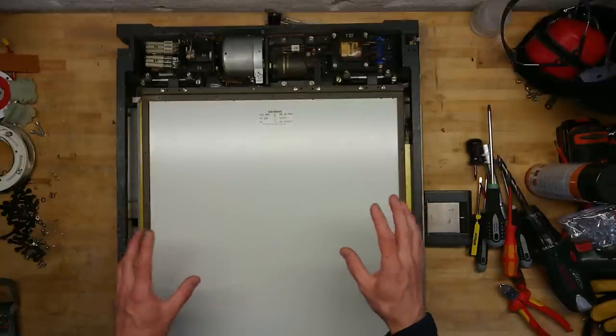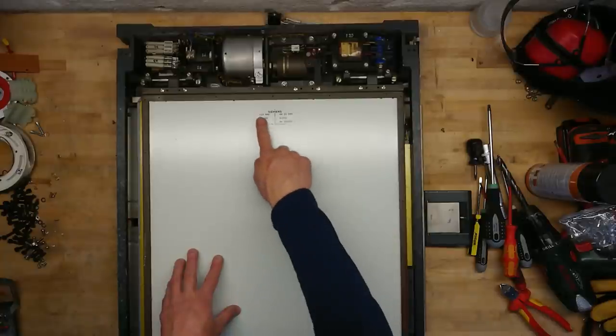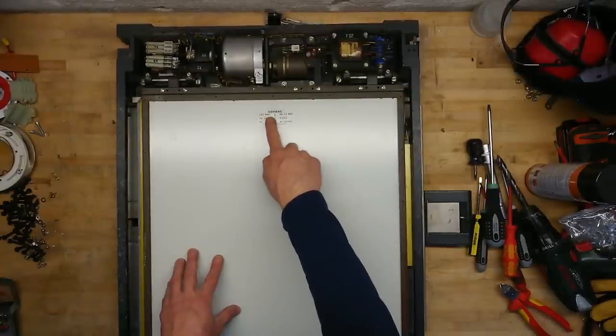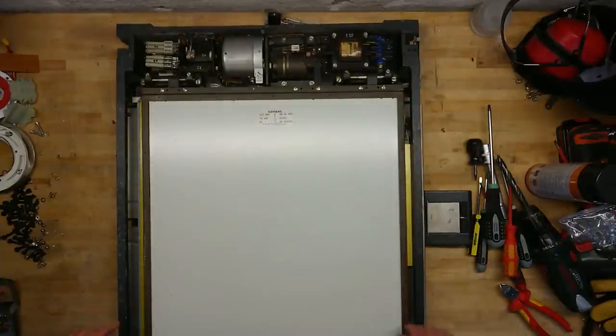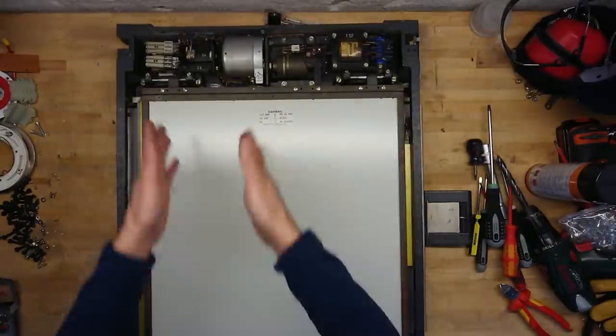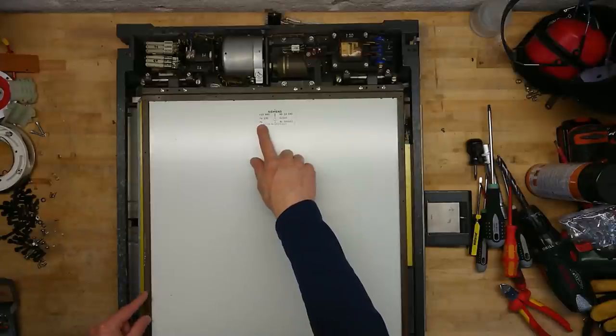Now, from what I can gather, this is called a grid plate. It has 12 rows times 40. So it's simply slits in a lot of rows and columns. Also has Pb.